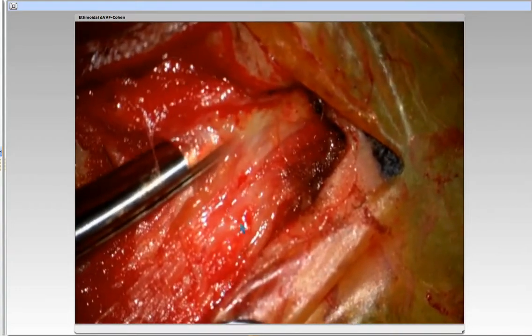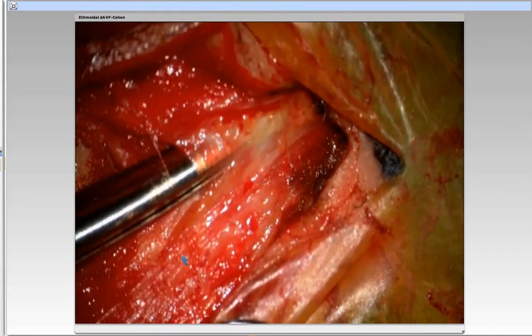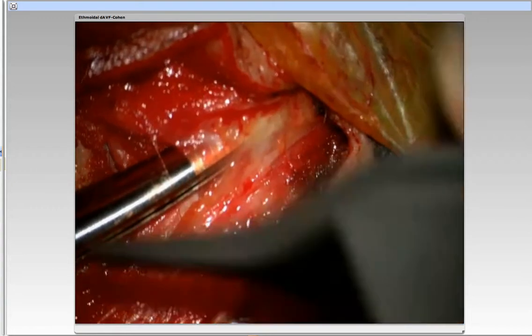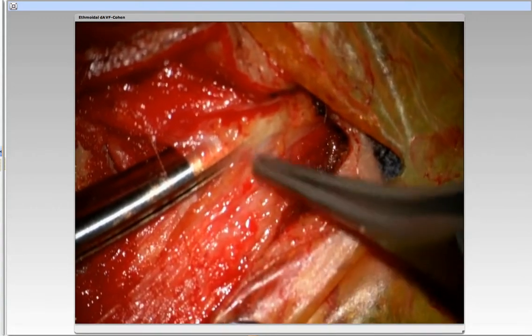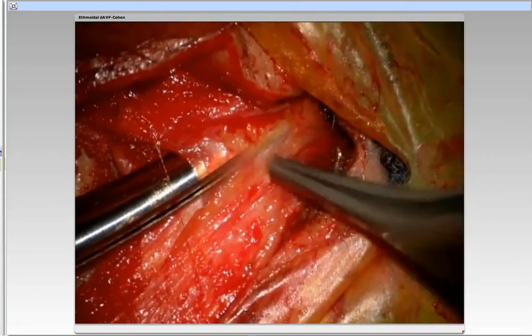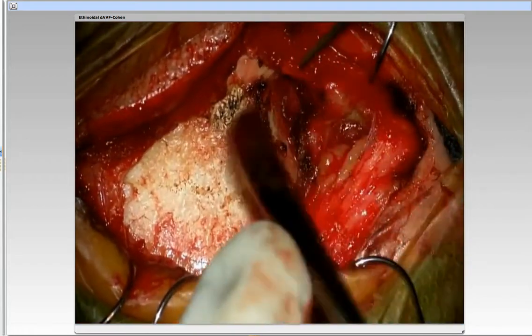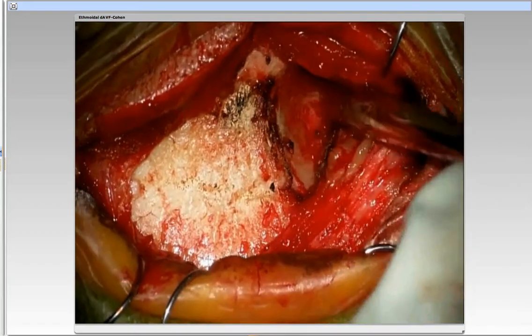Here is focusing down, and as you can see in a second, those are the branches of the frontalis nerve that obviously have to be preserved to prevent any cosmetic deformity because of frontalis palsy. Any other details you would consider important here, Johnny?